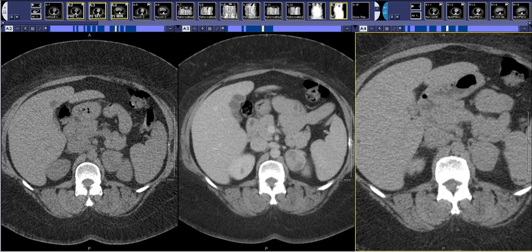It's also much cheaper than an MRI, although in younger people and people you want to avoid repeated radiation exposures to, an MRI certainly works very well for characterizing most adrenal masses. So there's pros and cons to each.